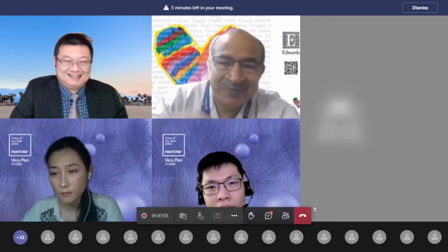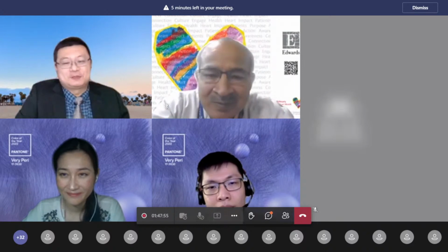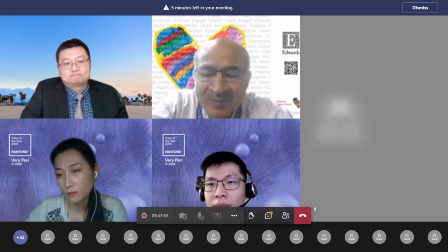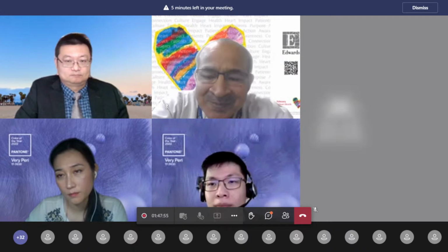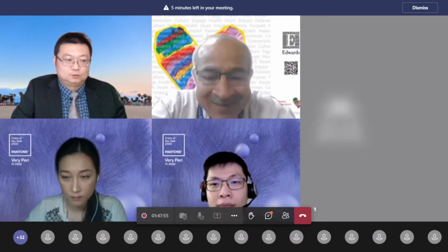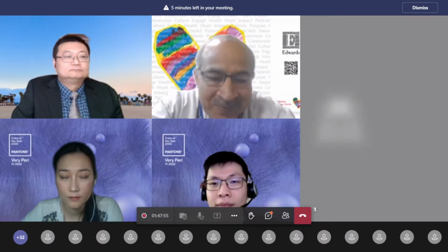Thank you for your experience and the presentation. PAC knotting is a rare but could be a disastrous complication. If you are interested, you can search PubMed. There are a lot of cases reported. The key to prevent this complication is do not insert the PAC too deep if you cannot get the corresponding pressure wave or pressure values. Okay, thank you very much.